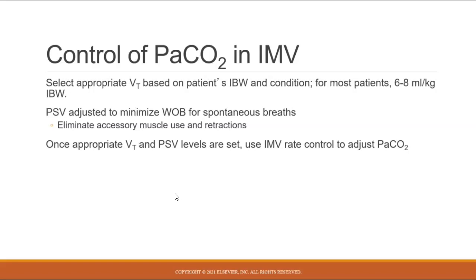Again, we did this in lab, so hopefully it makes more sense as you're watching this. Once you have that tidal volume set for the patient, you're going to rarely change it. Most of the adjustments are going to be made with that respiratory rate until you max yourself out with the respiratory rate, and then you have to go back to making potential adjustments to the tidal volume, or deciding, hey, I can't adjust anything and I'm just going to let the patient be a little bit hypercapnic.